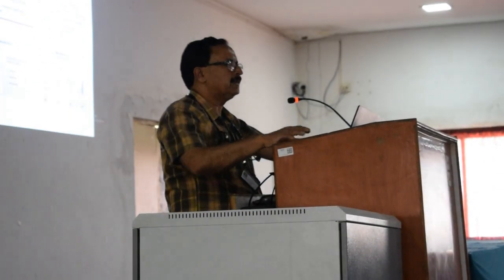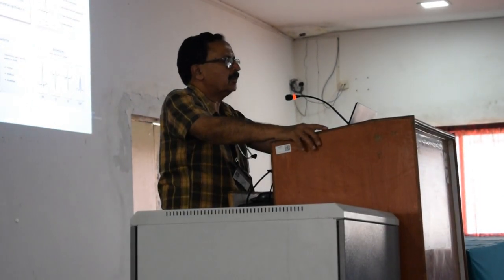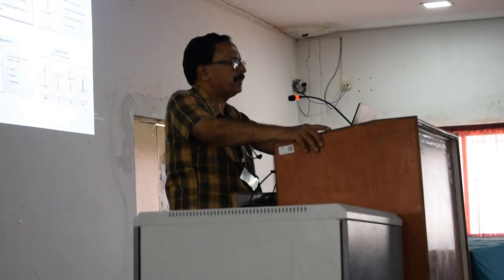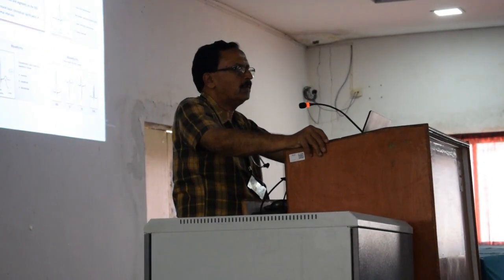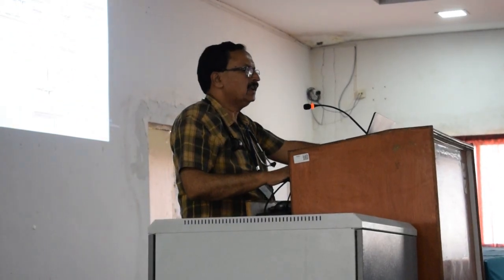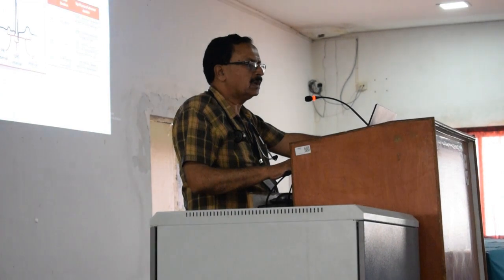So the learning objectives of our program are to recognize the normal waveform and know what physiological event each represents, and to identify intervals and segments and understand the basic significance of the abnormalities. So with this I feel that the understanding of the basics has been covered.